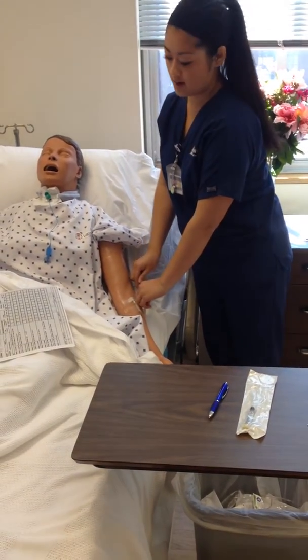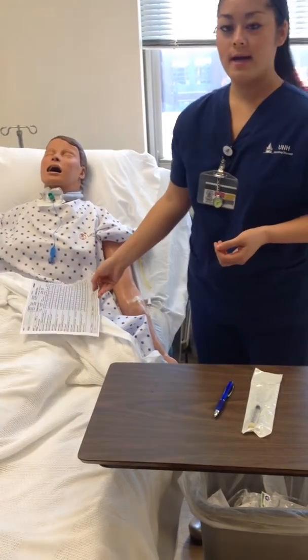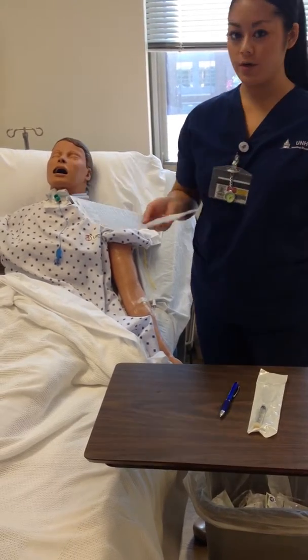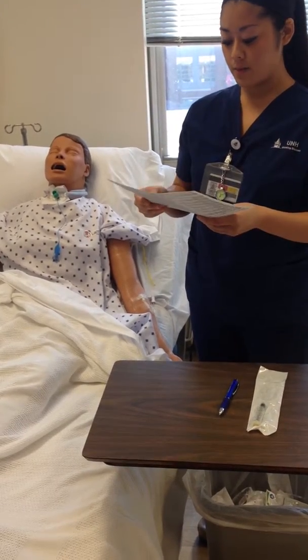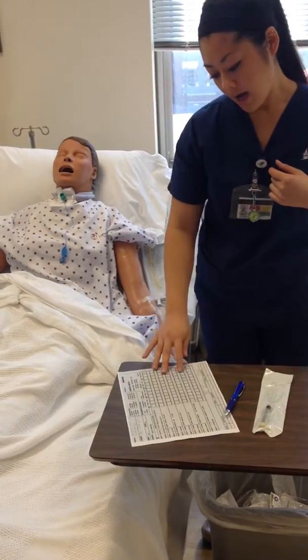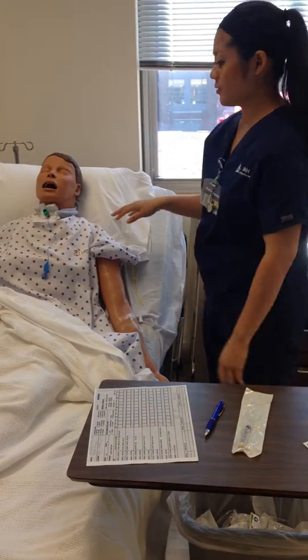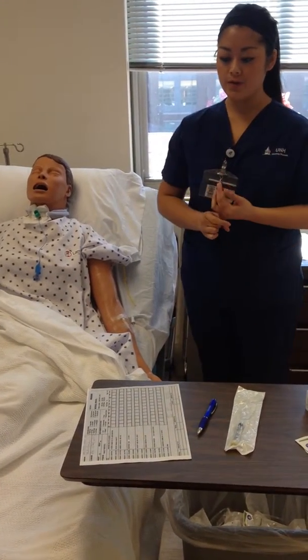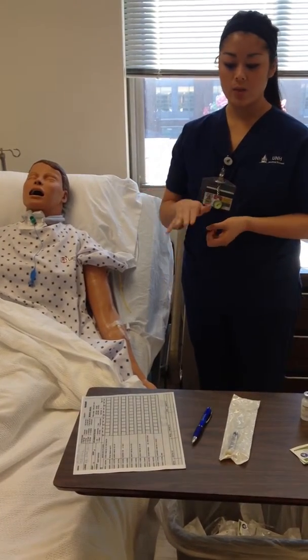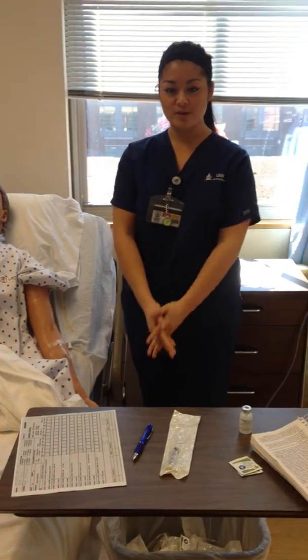That's done. So for documentation, depending on what hospital you're at, at Wildcat Hospital, you need your signature next to what you administered, and then also your partner nurse's initials, since they watched you draw it up and calculate it. And then after you document, after a few minutes, you want to reassess your patient. You want to redo their vitals, ask them for their pain on the scale again, and make sure that what you gave is having the desired effect. And that's IV push medication.